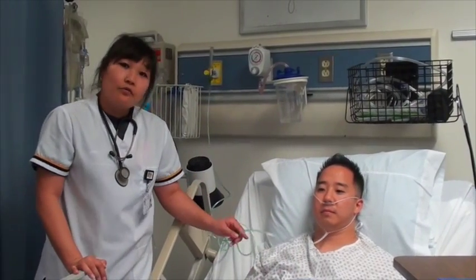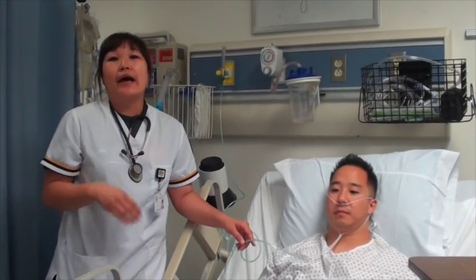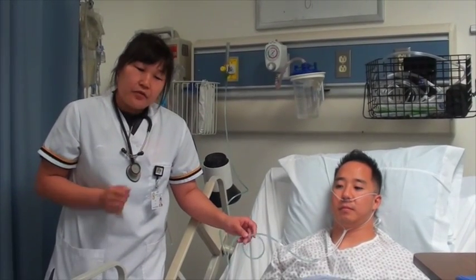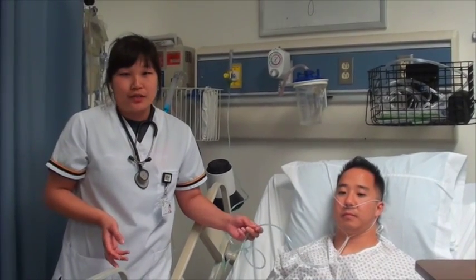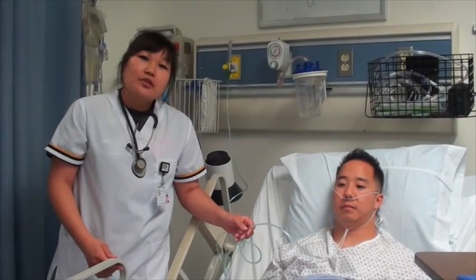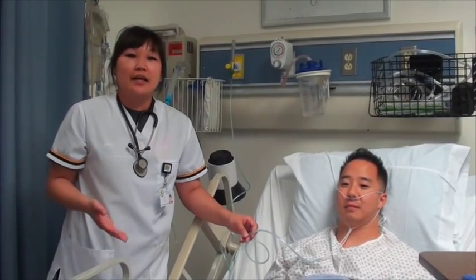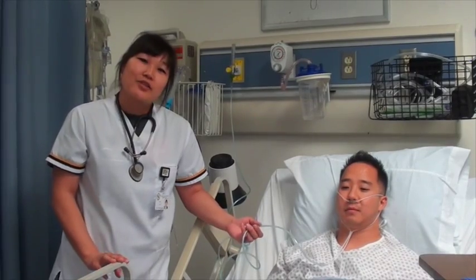This is considered a low flow device because it offers 24% at 1 liter up to 44% at 6 liters per minute. If you're giving more than 35 to 40% oxygen, then you don't want to use the nasal cannula. The nasal cannula is used to give a little bit of an oxygen boost, so if the patient has a pulse ox of a little bit less than 95%. It is also really good to be used for long-term oxygen therapy.